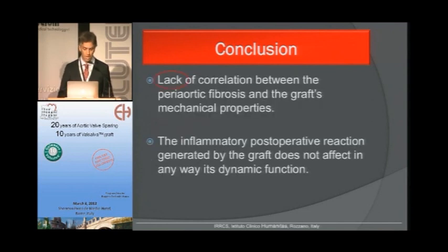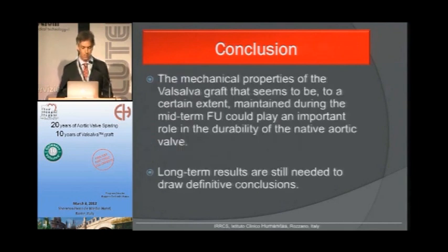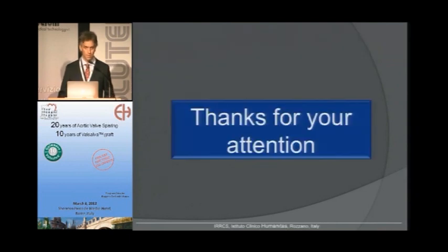We also found a lack of correlation between the periaortic fibrosis and the graft mechanical properties, indicating that the apparently inflammatory postoperative reaction generated by the graft does not affect in any way its dynamic function. The mechanical properties of the Valsalva graft seem to be, to a certain extent, maintained during the midterm and could play a role in the durability of the native valve, but of course long-term results are needed to confirm this data. Thank you very much for your attention.